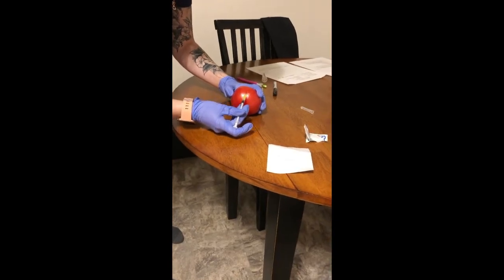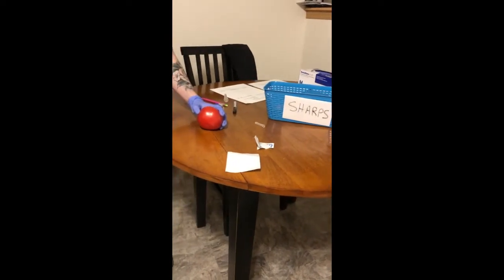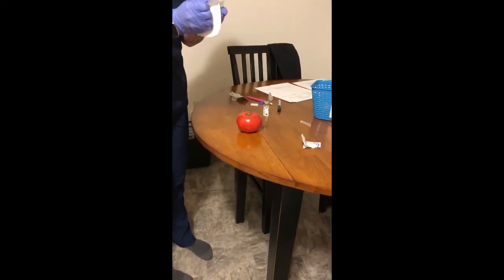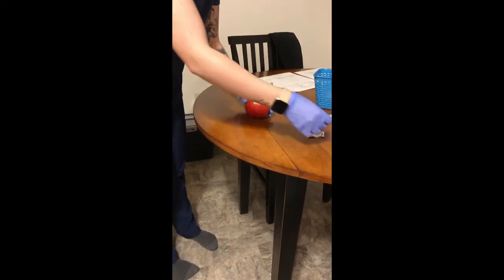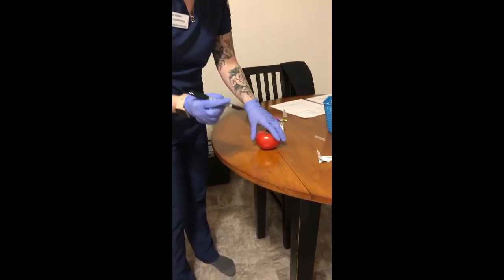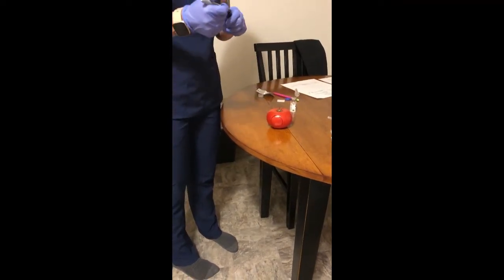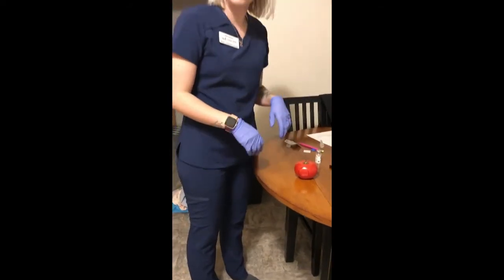And then you want to take it out, put it into the sharps container. You can blot it with a gauze pad. You don't want to rub it or put a Band-Aid over it. What you're going to do is put a 1-inch diameter circle around your bleb, and you're going to tell them to come back in about 48 hours and then have a nurse check it again to see if there's any redness or anything.